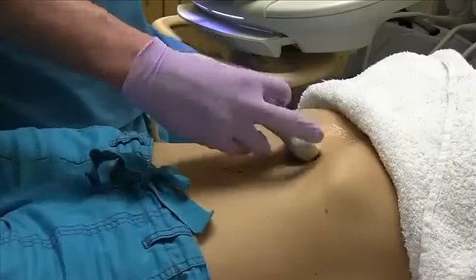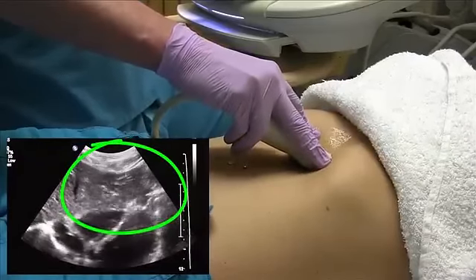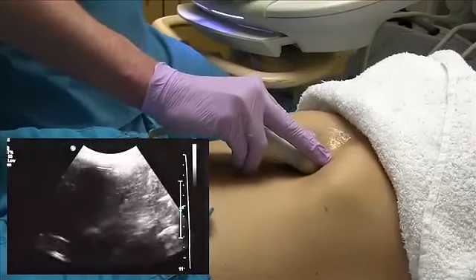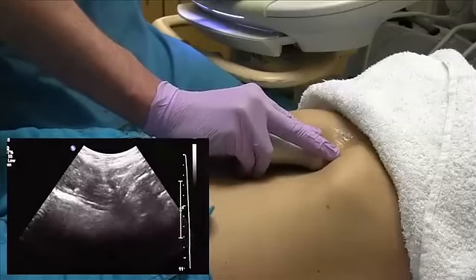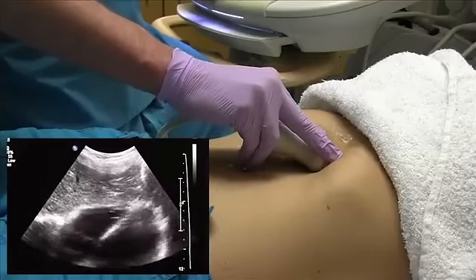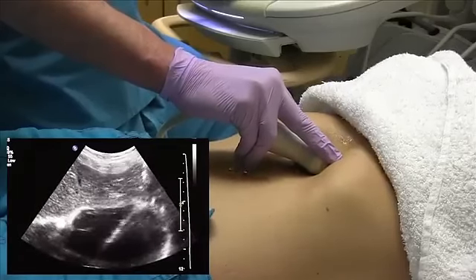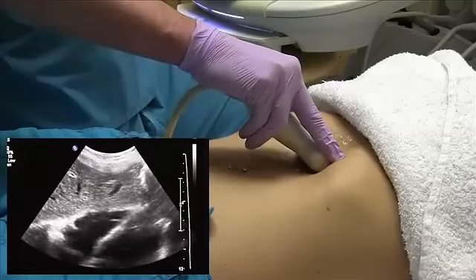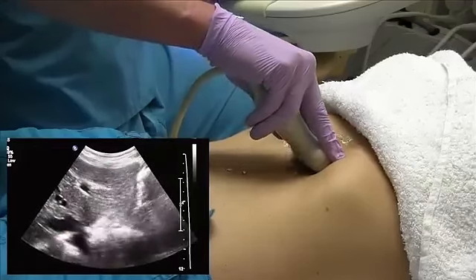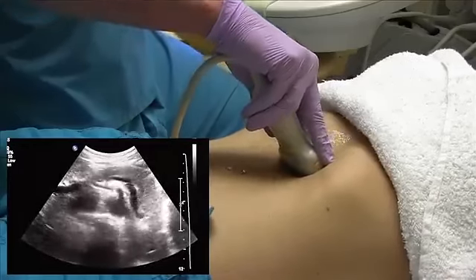Next we go transverse, and for that we're going to start again with the left lobe, subxiphoid, and you kind of grab the top of the probe here, and you want to make sure you sweep all the way up through the left lobe till you see the heart. And then as you come down, very similar protocol, you start at the top of the left lobe with the parenchyma. Coming down, you'll see the hepatic veins. And then last, you're going to see the portal veins. And you sweep all the way out of the left lobe here.